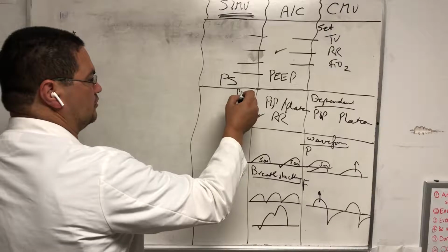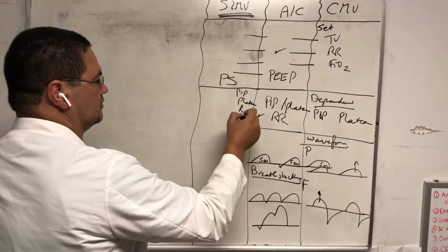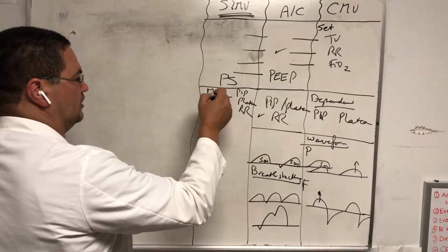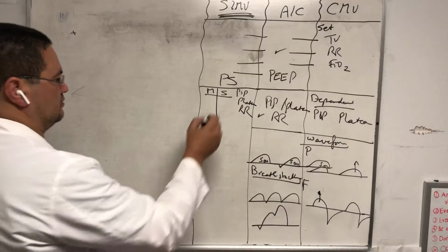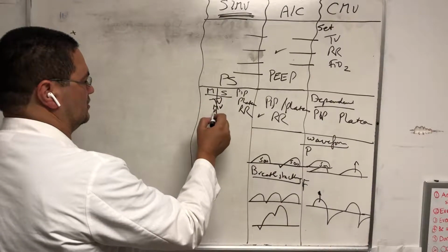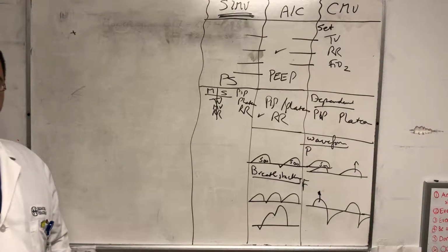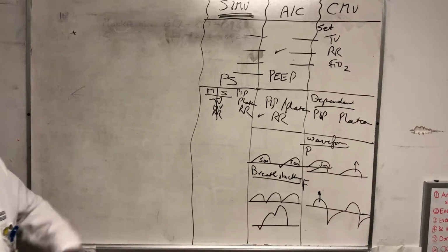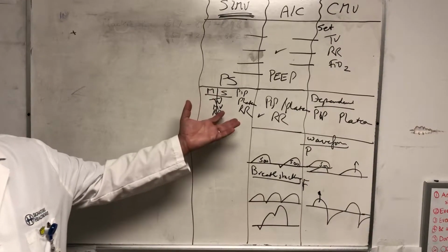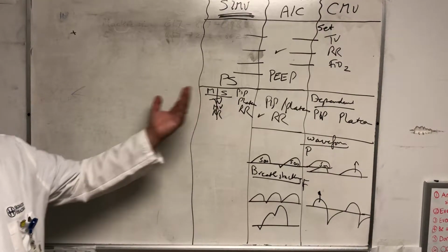We have peak inspiratory pressure, plateau pressure, respiratory rate, and also anything that has mandatory and spontaneous before it. So spontaneous tidal volume, mandatory tidal volume, spontaneous minute ventilation, mandatory respiratory rate. So basically, there is a lot that tells you what happened here. Obviously, there is a spontaneous and mandatory component to your breathing, and not only that, the vent's advancement.